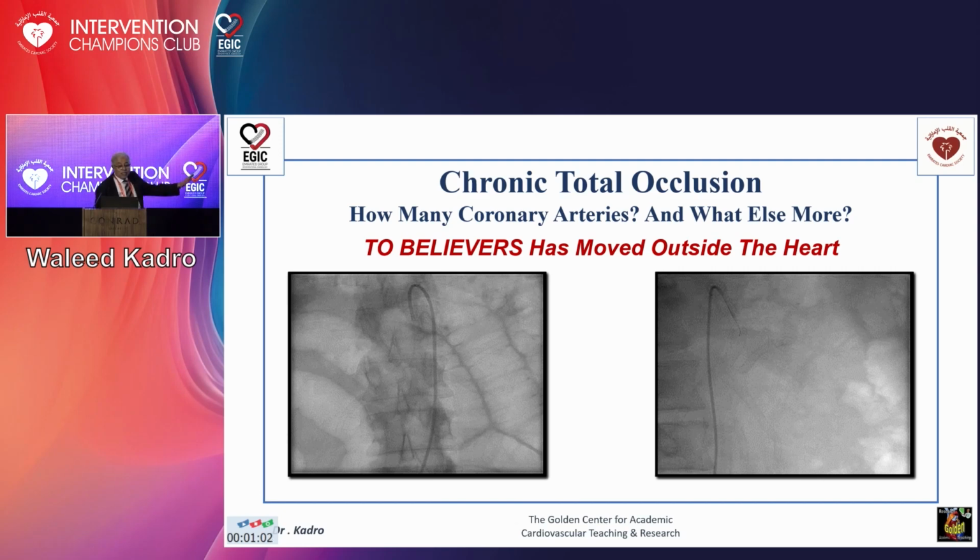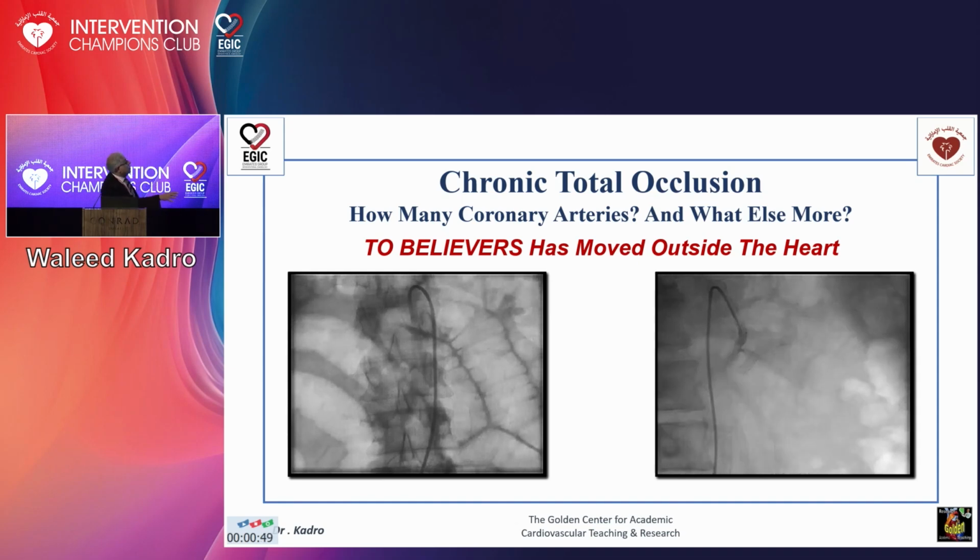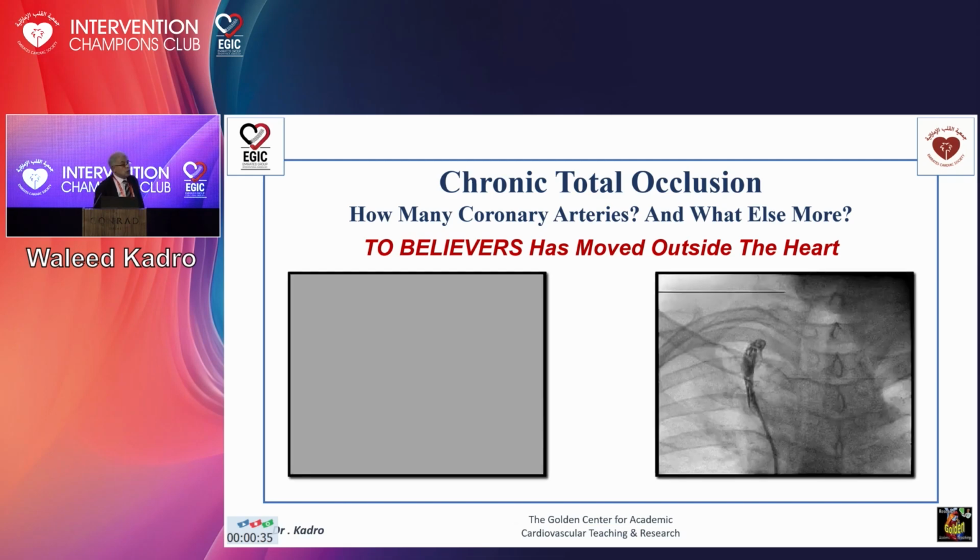That's the last one. This is severe chronic mesenteric ischemia, nothing going to the mesenteric. Almost he's having dead bowel, and we took the patient from the table of the OR surgery because he's going to major resection. We were able to recanalize all his mesenteric arteries, and he ended up with resection of only 10 centimeters of the small bowel.